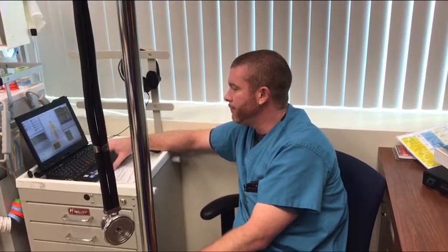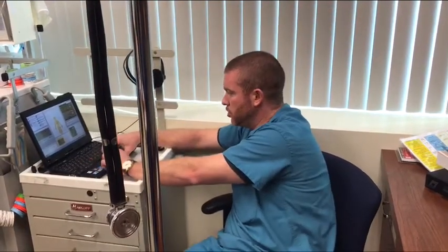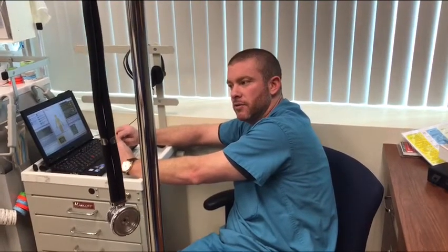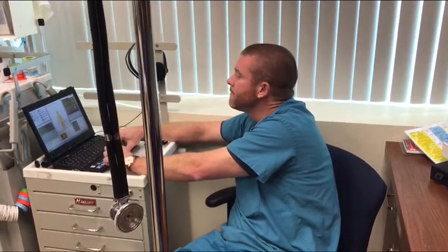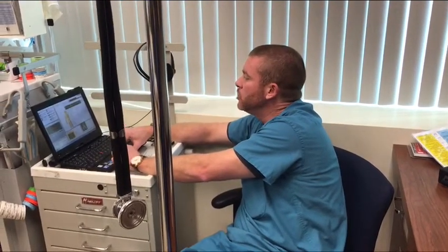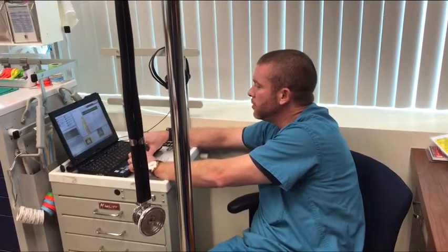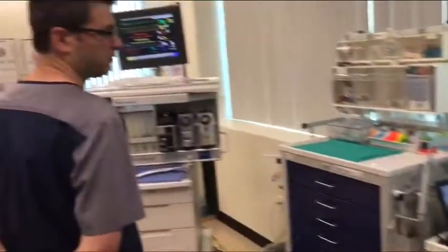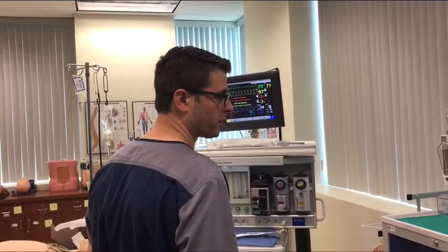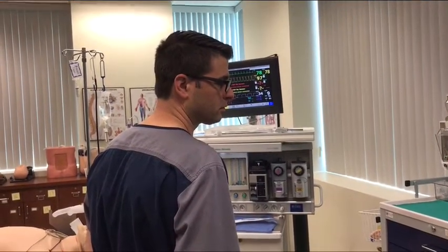Okay, go and lower the table. You hear the surgeon talking and they're saying things like lower the table, or Veress needle. Okay, that's good. And you hear them start to say Veress needle, you're thinking what? What are you thinking? They're about to insufflate. Well, getting close, right. So what are you going to be looking for?